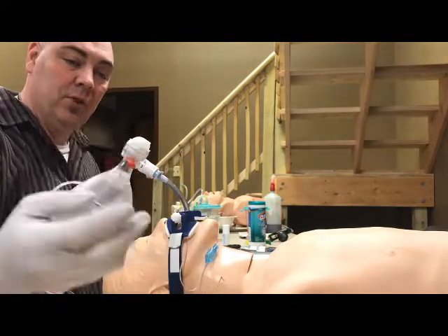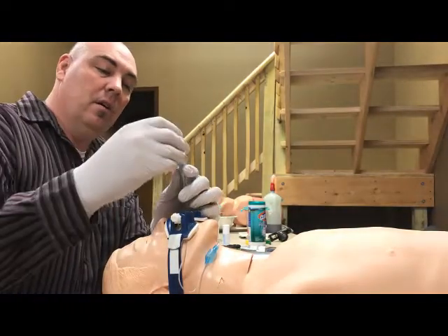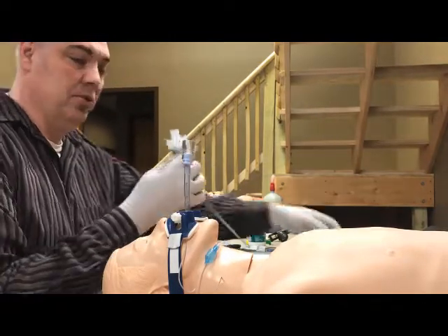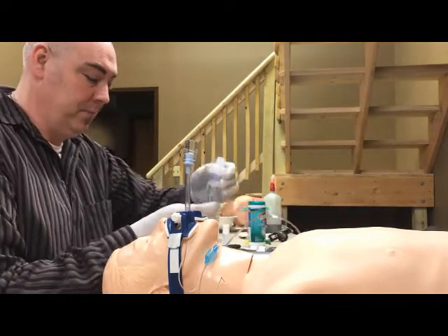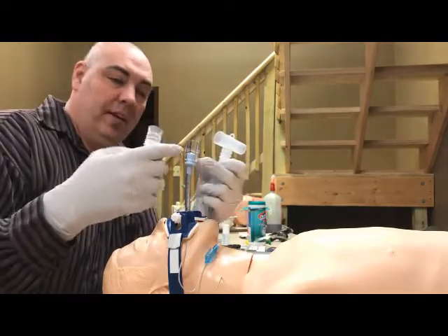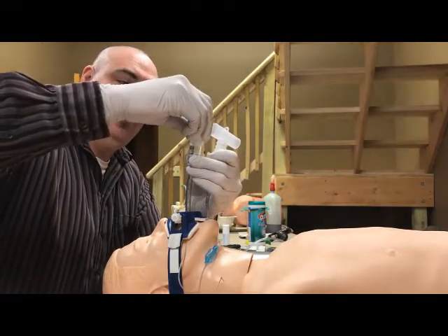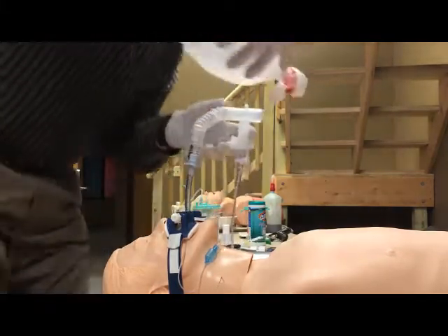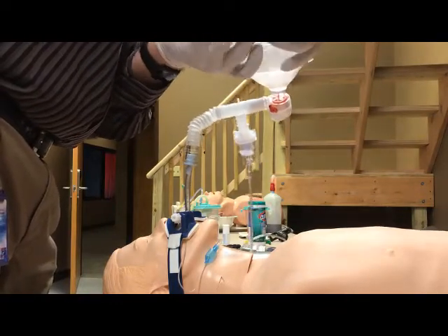Here's how this works: we're going to remove the BVM from the ET tube. We take the larger part of the adapter and put it over the ET tube. With the albuterol set up and running at six or eight liters per minute, we attach the T-connector. This adapter allows us to use the corrugated tubing to connect to the endotracheal tube, which plugs into the T-connector. Then we put our bag valve mask on and bag the patient in line with the nebulizer.